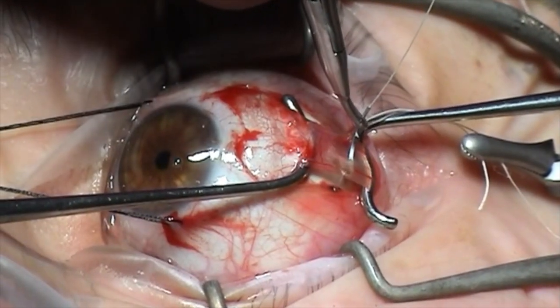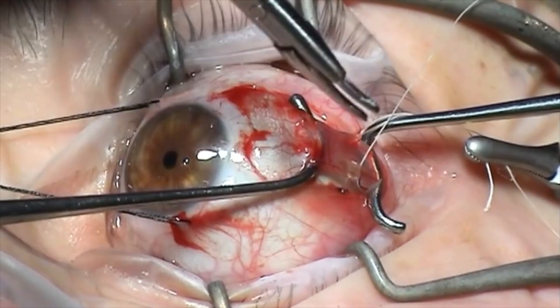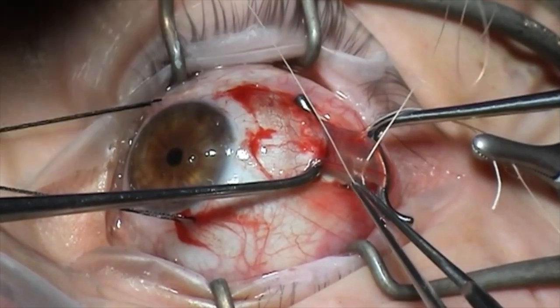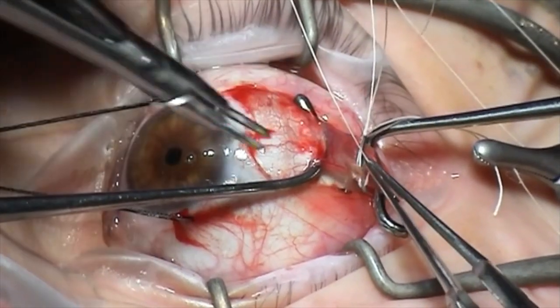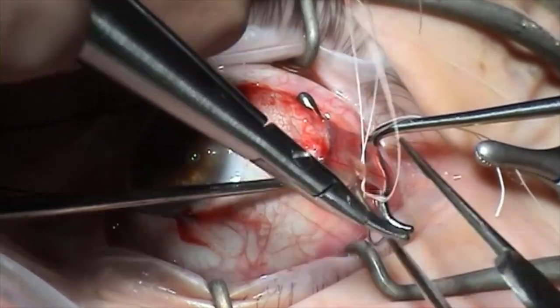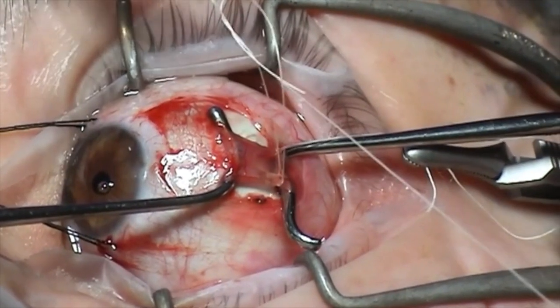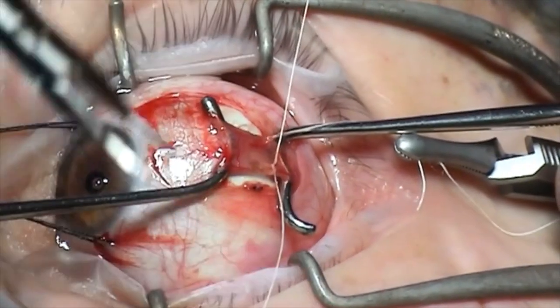Reverse-mounted needle passing through the lower third, emerging through the edge of the muscle, twisting one's wrist around to grasp the needle, and then holding the suture short so it can be passed underneath the body of the needle to make it point up towards the needle holders. Some surgeons prefer to put one or both sutures on a bulldog clip.